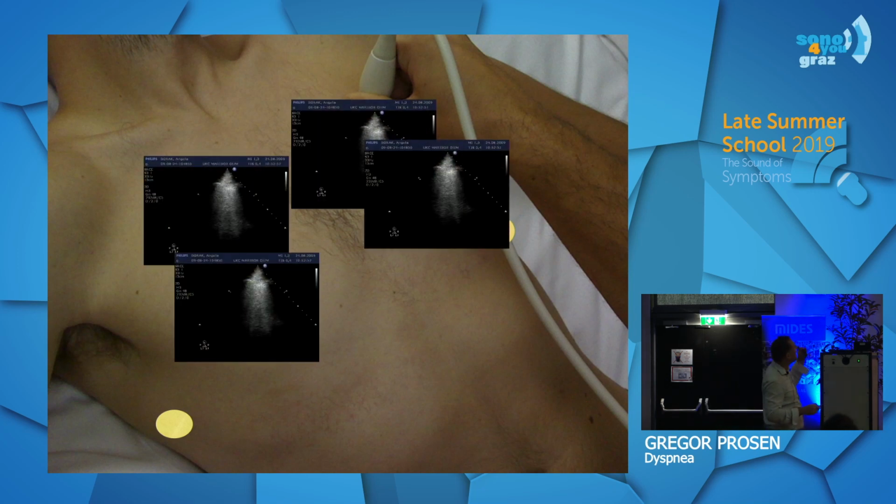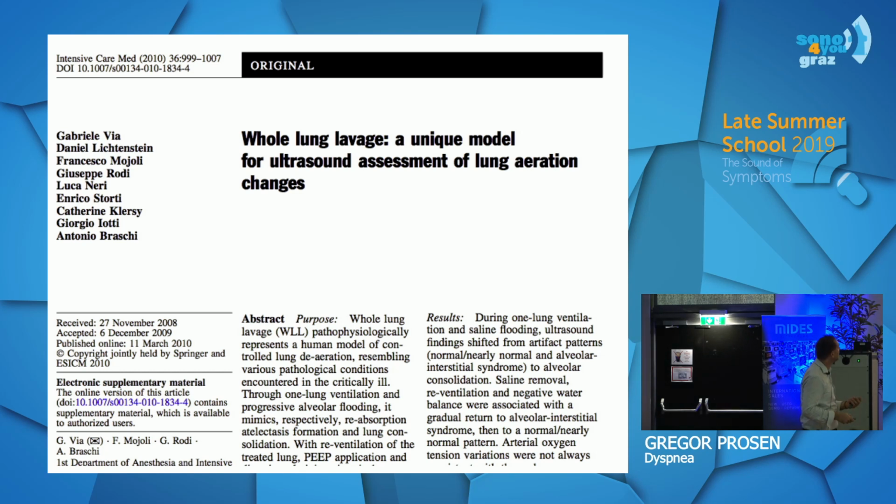In cardiogenic pulmonary edema, because this is increased venous and capillary pressure, we expect diffuse increased pressure and diffuse interstitial syndrome. You agree? So we expect diffuse B lines here and here and everywhere. But with localized pneumonia, which is not RDS yet, we expect them only here or here. Where we have crepitations, there we also expect the B lines.